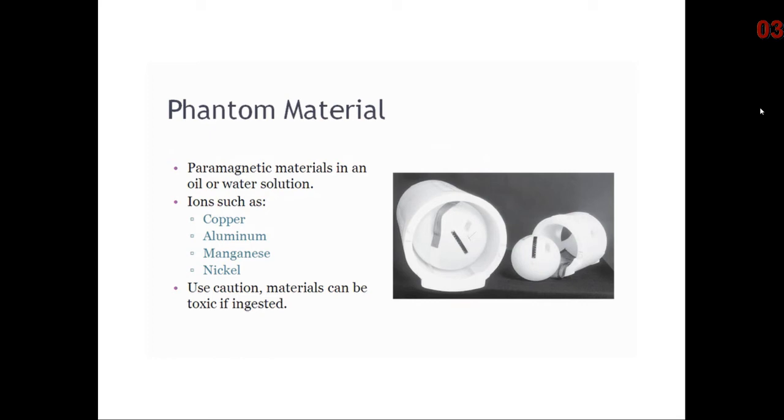QC phantoms come in many different shapes and sizes and contain different geometric variables. The same vendor QC phantom can be used to test signal-to-noise ratio and resonant frequency, while a different ACR phantom is needed to test for spatial resolution and linearity.